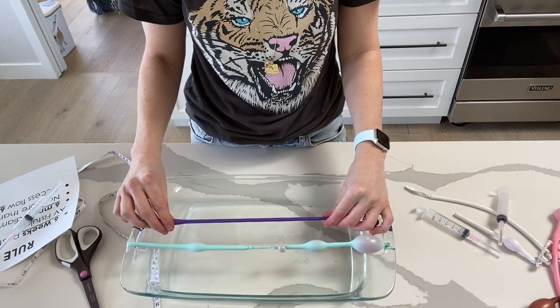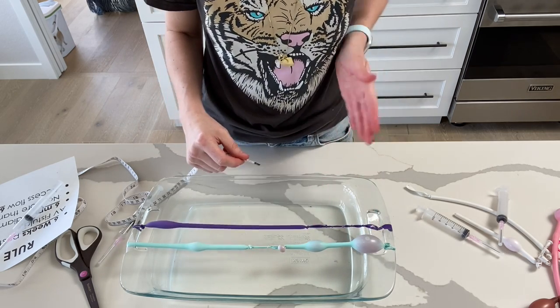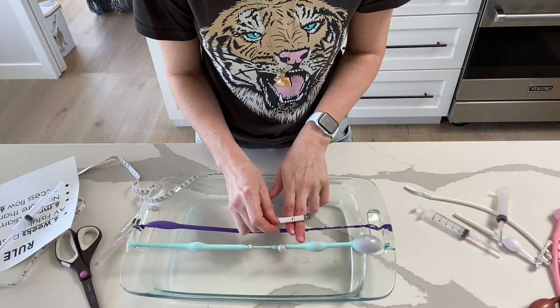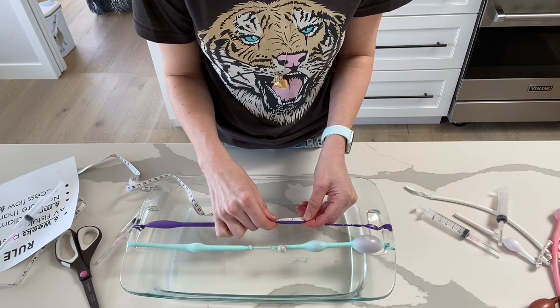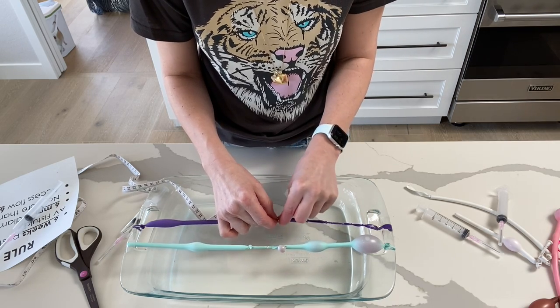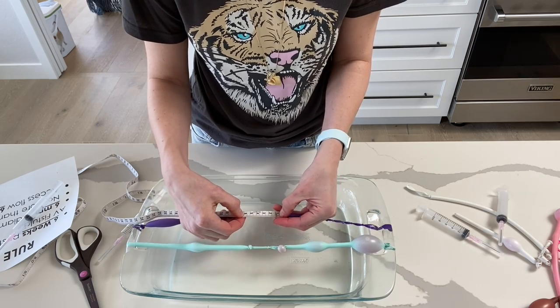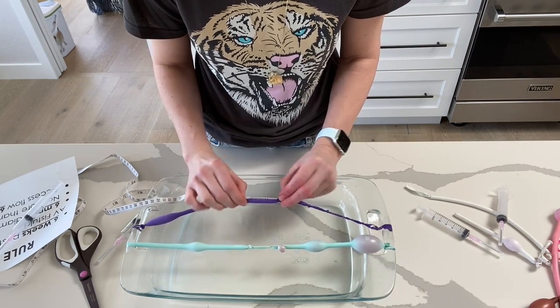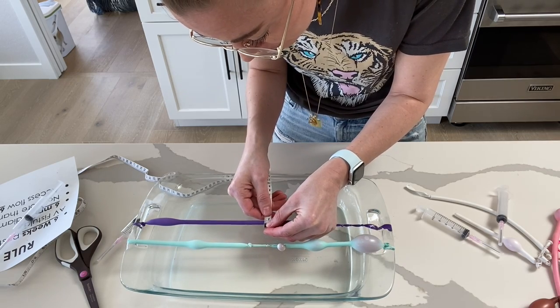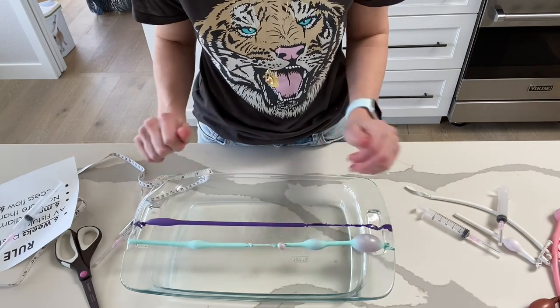Here is my fistula. We're going to start with this purple balloon and I'm going to give it a quick measure. With every fistula there's an anastomosis — the surgical incision connecting the artery to the vein. We want to start measuring at least two finger widths — about an inch and a half — from the anastomosis. I'd recommend starting cannulation about two inches up, because cannulating too close to the surgical incision will cause high arterial pressures due to low flow. Measuring here, we have about six centimeters, and the diameter is about six millimeters — actually pretty much what you'll see with a new fistula.